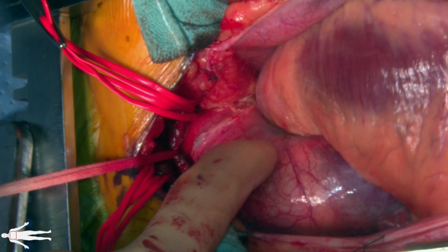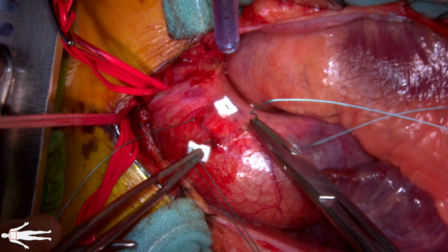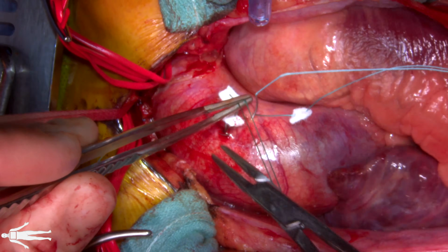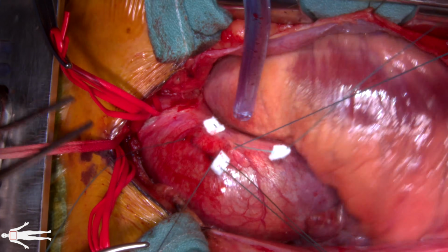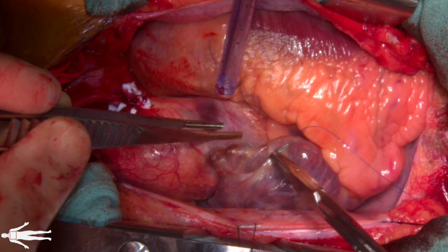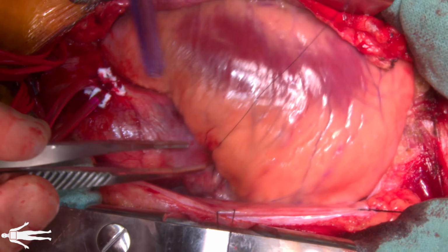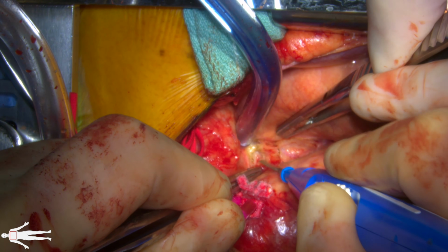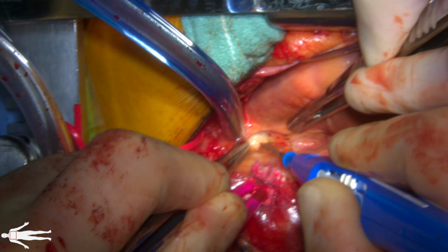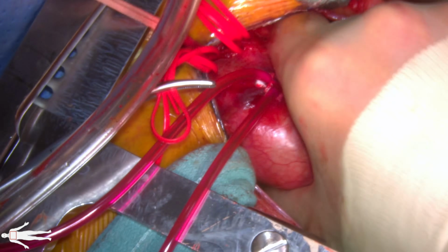The immediate ascending aorta appeared bruised, consistent with a type 1 aortic dissection. Two pleated purse string sutures were then placed in the distal ascending aorta, as well as a purse string suture along the right atrium to accommodate arterial and venous cannulation. The ascending aorta was then carefully mobilized from the pulmonary artery trunk and circumferentially freed to prepare for cross-clamping.